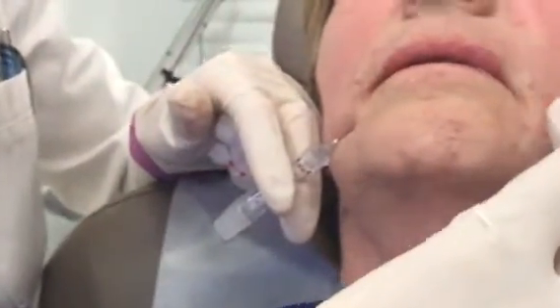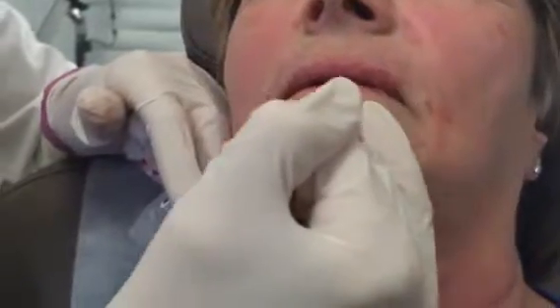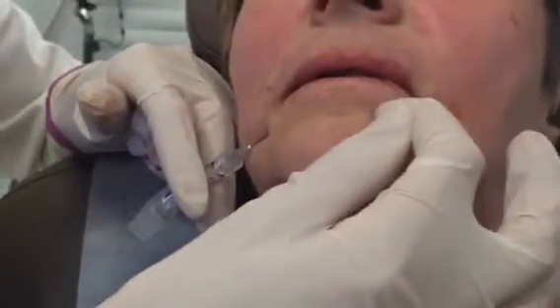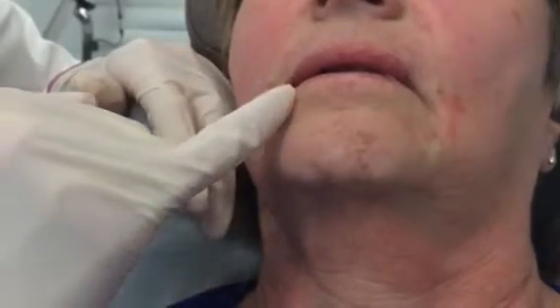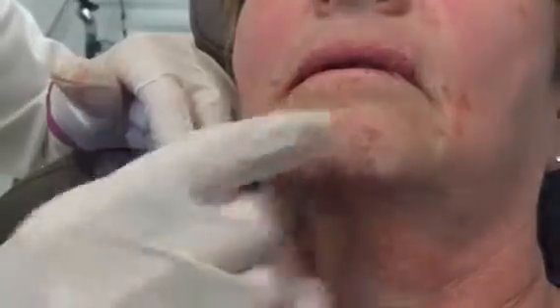This time I'm using the cannula again, so we're going to zero in on the patient. I've actually worked on her left lower side a little bit. You can see that it's helped fill in that area where she's got some volume loss just right under this portion of the red lip. And now we're going to be working a little bit in this area of the right lower lip using the cannula.